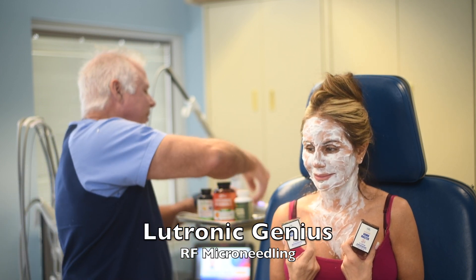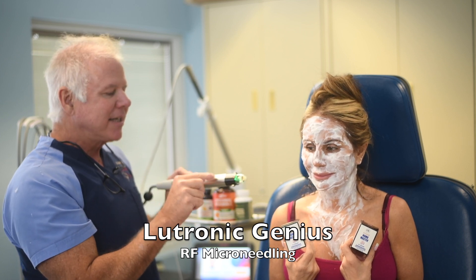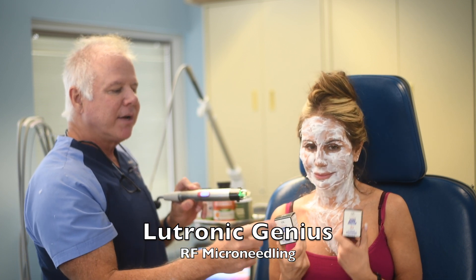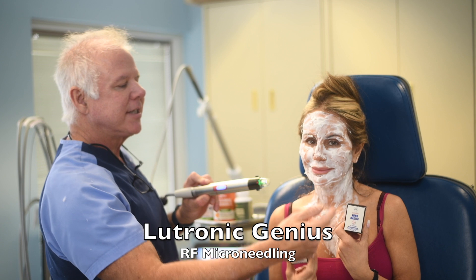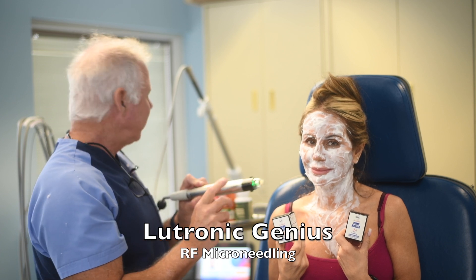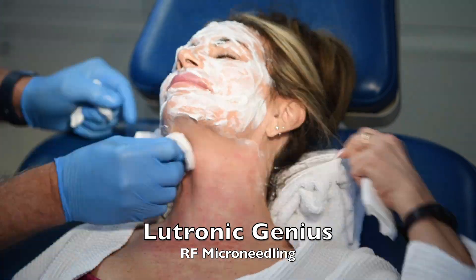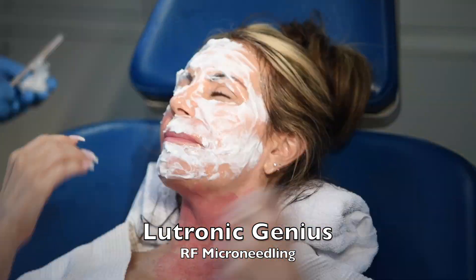You can infuse peptides through radiofrequency microneedling as well, but with RF microneedling the needles would actually hurt if it weren't for numbing. She applied one whole jar of topical numbing cream, and half an hour later put a second one on. It's very thick because otherwise this would hurt, but with one hour of topical numbing it will be comfortable. We removed the numbing one section at a time and performed the RF microneedling over about 35 minutes on an entire face, neck, and décolletage.